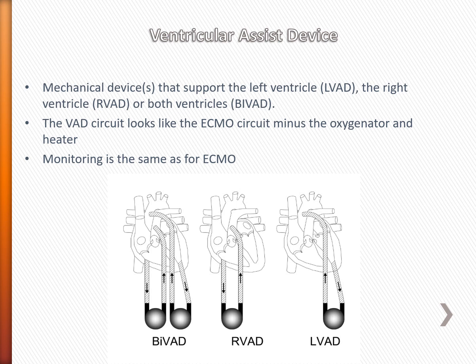A VAD circuit looks a lot like an ECMO circuit. Mind you, it won't have an oxygenator, and because it doesn't have an oxygenator, it won't have a heater. And the monitoring for that is the same as for ECMO.